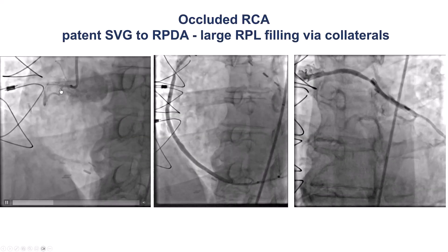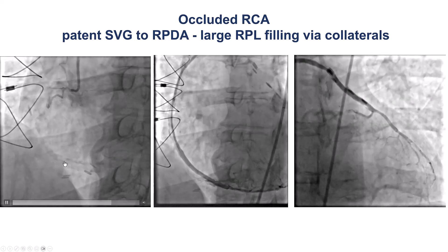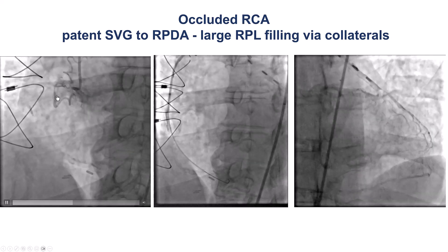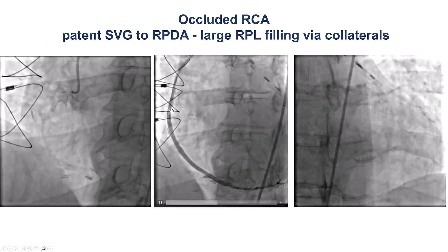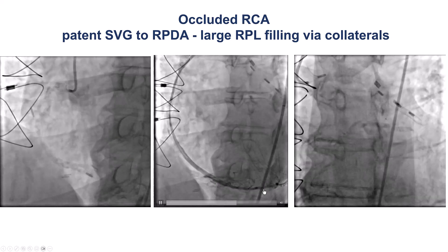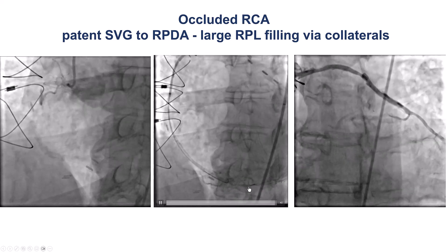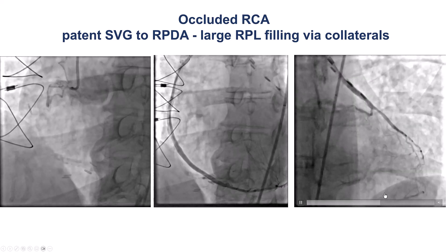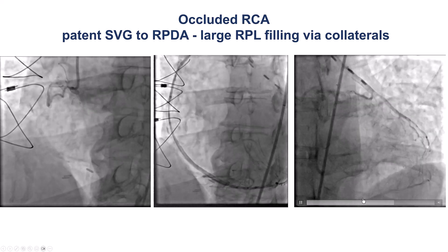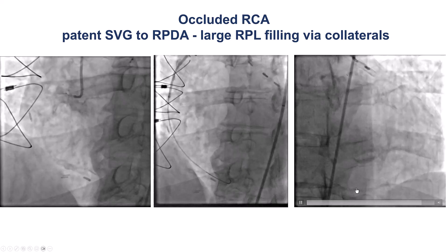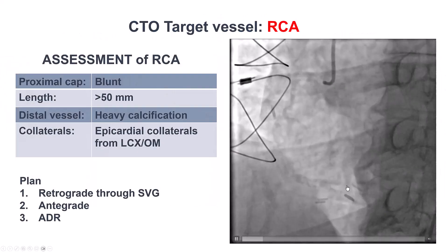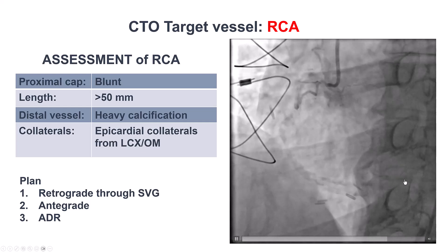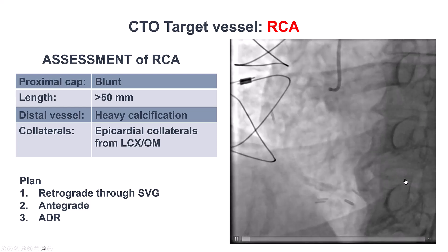On coronary angiography, there is heavy calcification of the right coronary artery with a proximal right coronary CTO and a patent saphenous vein graft supplying the PDA. However, there was a sizable right posterolateral branch that was filling through epicardial collaterals from the left. So the target was to open the right posterolateral branch.